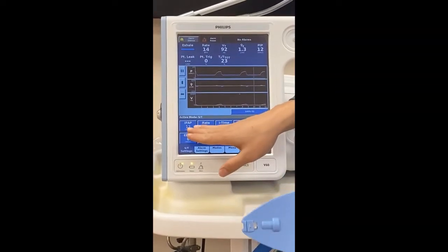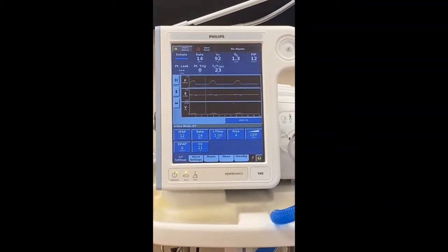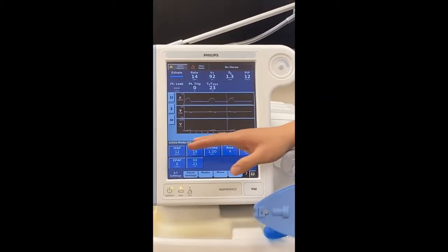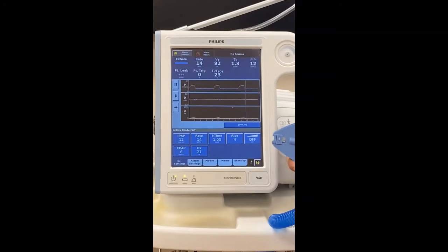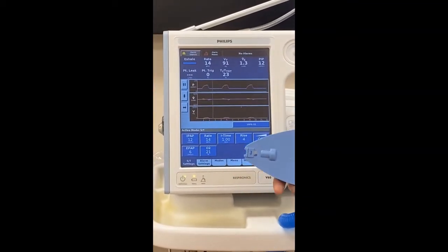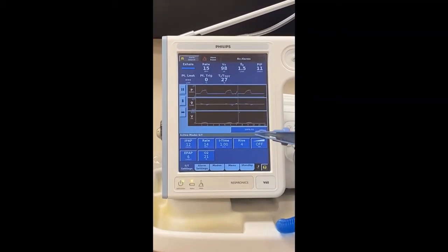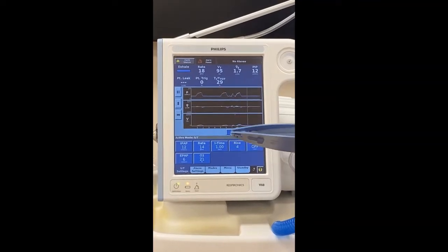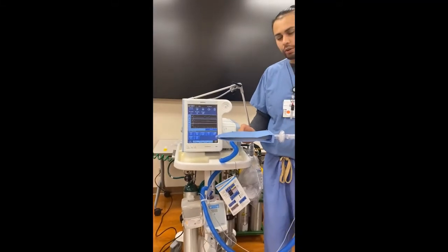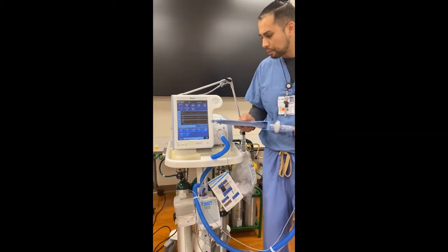So we'll first discuss the IPAP here. IPAP is the inspiratory positive airway pressure. Think of CPAP. CPAP is a nice continuous pressure that gives the patient. That's what IPAP is. It's going to be a set pressure that the patient is going to receive at a constant positive airway pressure. We do have an EPAP. Now EPAP is the PEEP when it comes to BiPAP. That is the expiratory pressure that will keep the lungs inflated and keep a little bit of pressure to keep them distended and help with oxygenation.